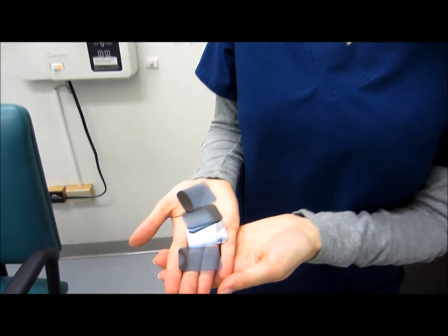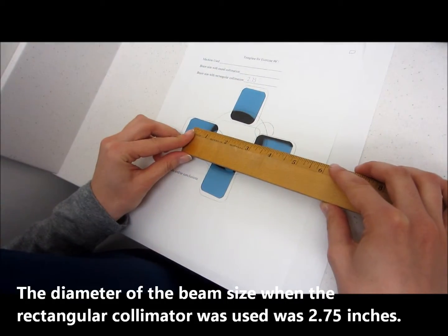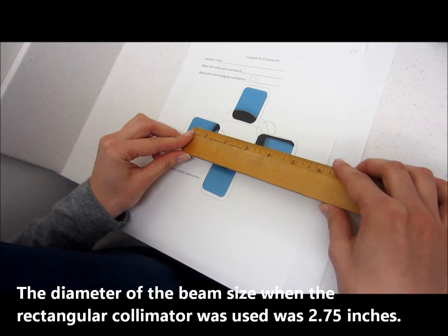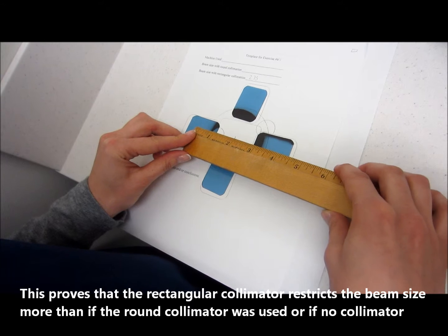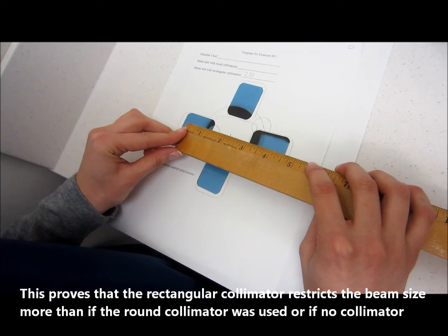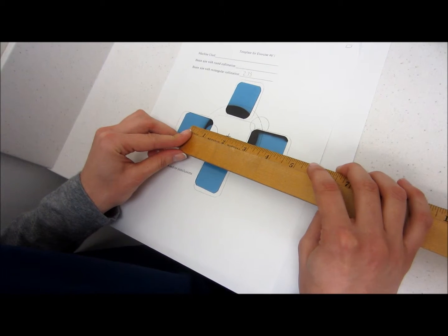Okay, these are our processed films. The diameter of the beam size when the rectangular collimator was used was 2.75 inches. This proves that the rectangular collimator restricts the beam size more than if the round collimator was used or if no collimator was used.